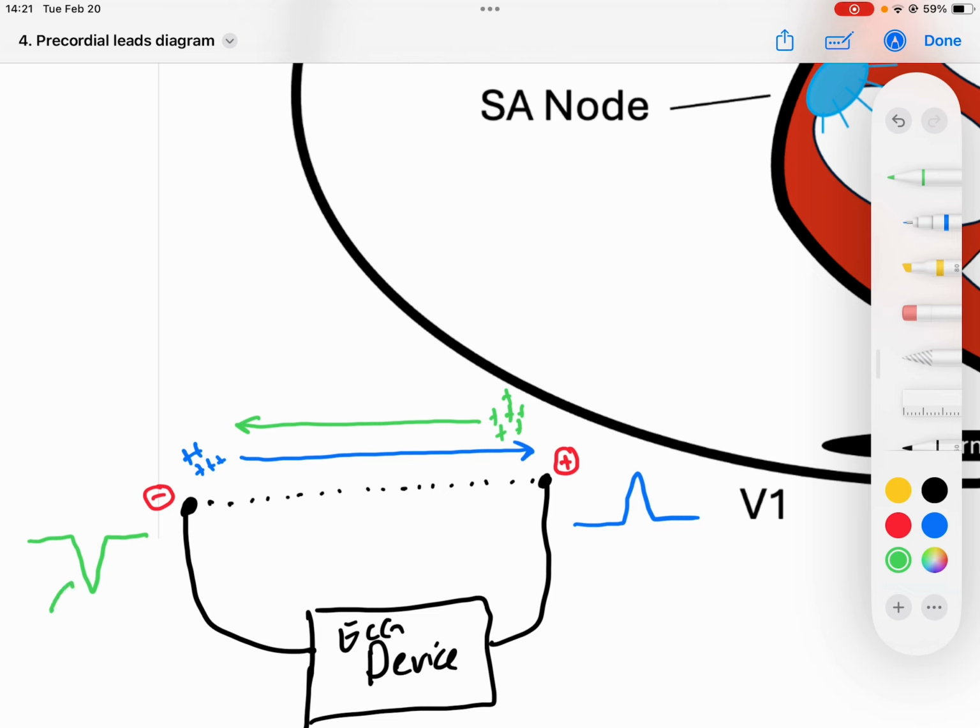The amplitude of these deflections, which means the height of these deflections, depends on the total amount of positive forces, right? So from a cardiac standpoint, how many heart cells, the density, as well as how well it aligns with that force.